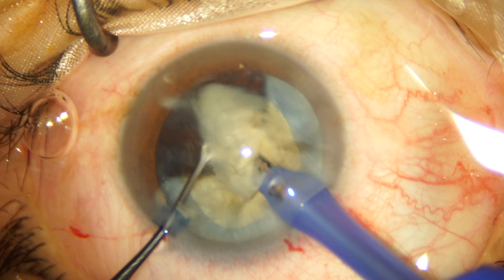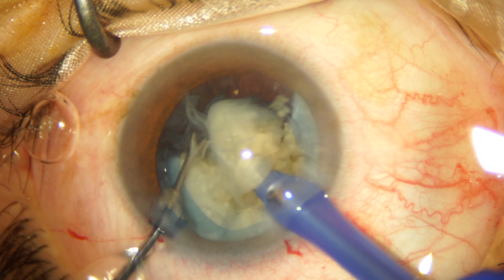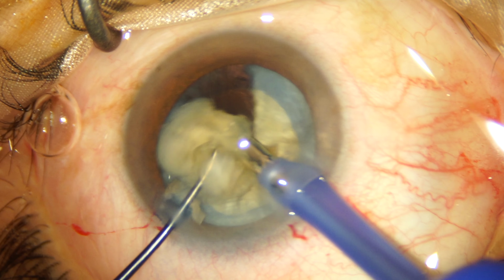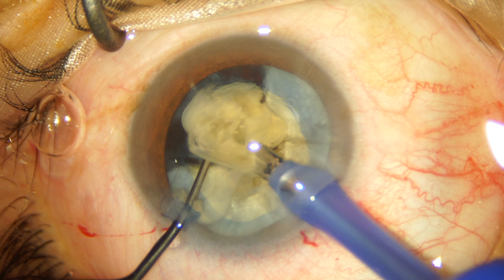Dear friends, I'm using 70% phaco power pulsed at 35 pulses per second with a 60% cool time, and I use a vacuum of 450 millimeters of mercury with a 45 cc per minute aspiration flow rate whenever I'm dealing with a mature or a hard cataract.